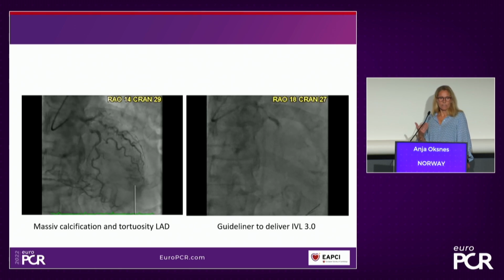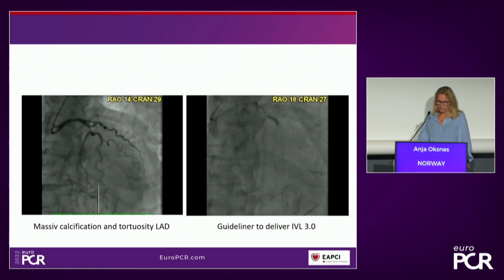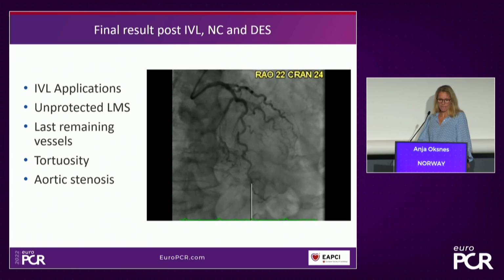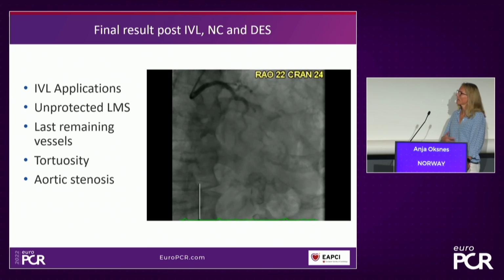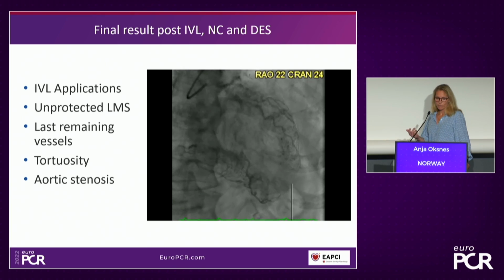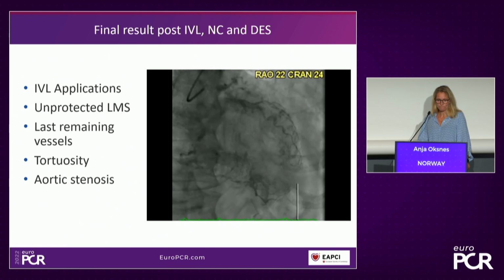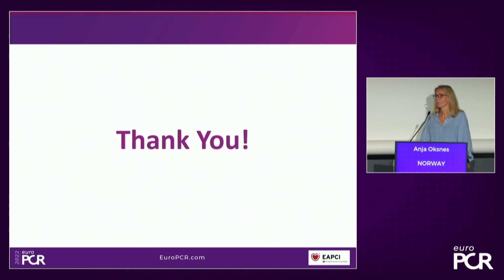So even though this is a last remaining vessel, high-risk case, it's important to have efficient tools to treat the calcium, and this was an excellent result. So it can be used in unprotected left mains, and like this, last remaining vessel, tortuosity, aortic stenosis. Thank you.